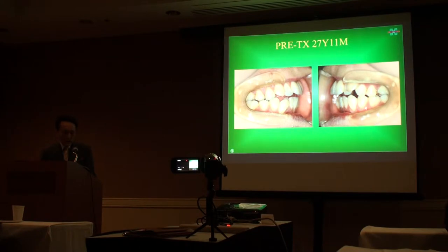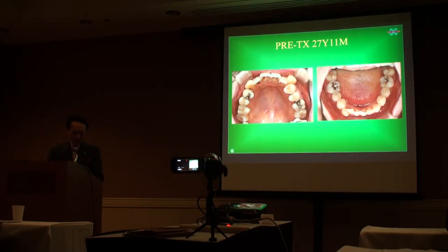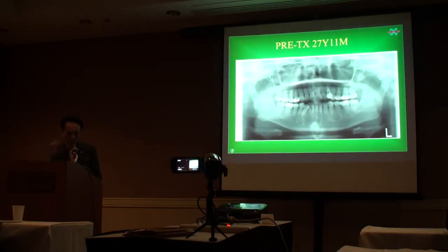In the lateral view, the right molar relationship was Angle Class 1 and the left molar was Angle Class 2. Left upper canine and right lower canine were divergent to the labial side. There was a severe amount of crowding in both the upper and lower arch. The panoramic X-ray shows no root resorption and the alveolar bone level is normal. All 4 third molars were absent.